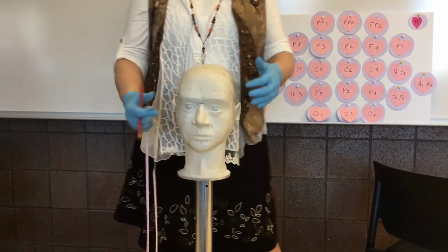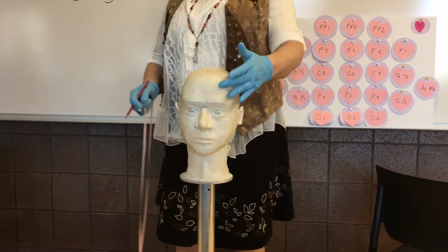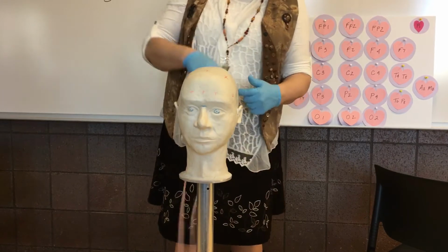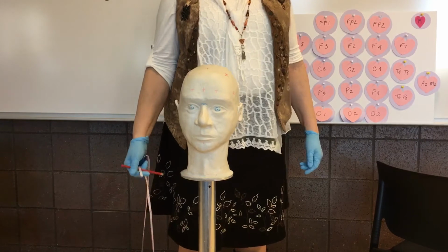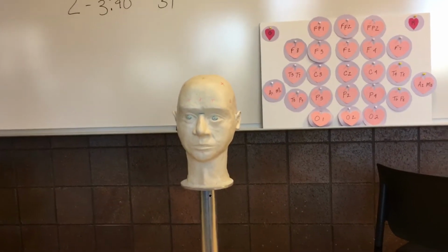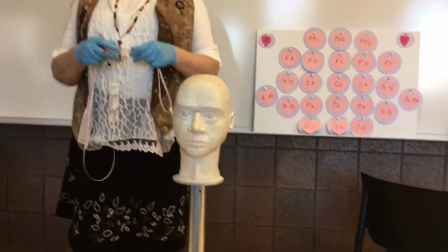And if we were to link these electrodes together in chains, the chain on the left should match the chain on the right. The chain here should match the chain here, right? If I were to measure all the distances between each of these around the circumference, they should all be equal, right? That's what you're documenting on this 10-20 measurement documentation. You're going to mark any deviances that you might have. We need to have our electrodes 5 millimeters or less in deviance.